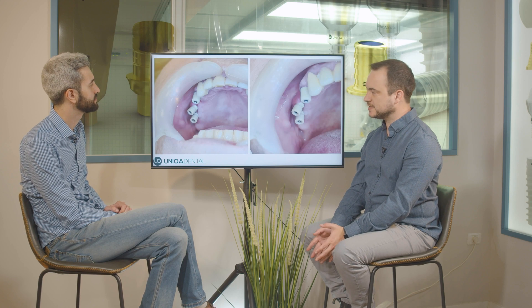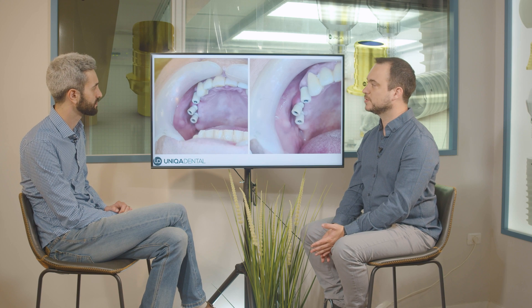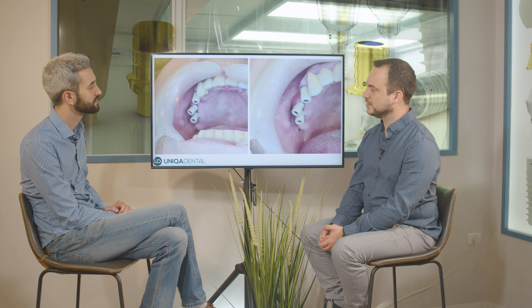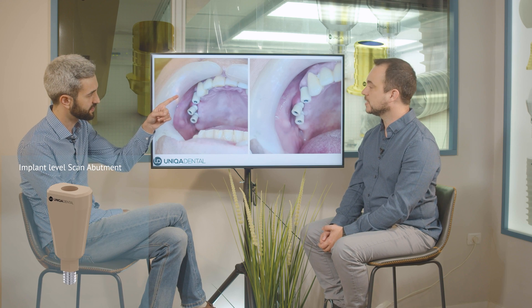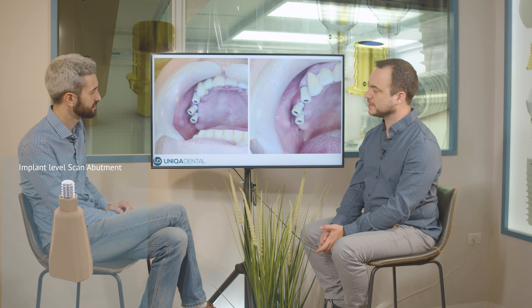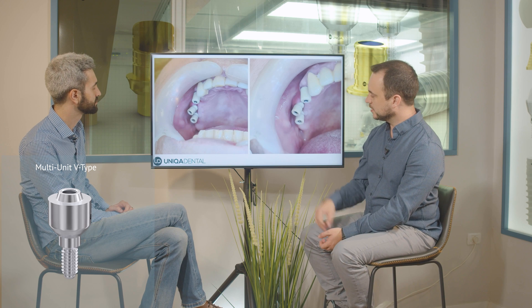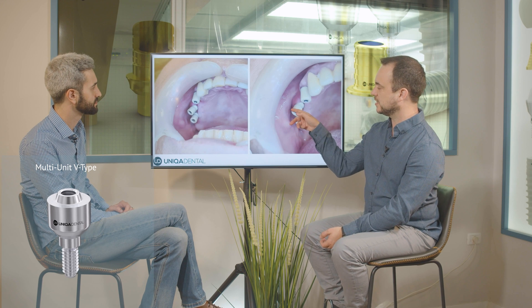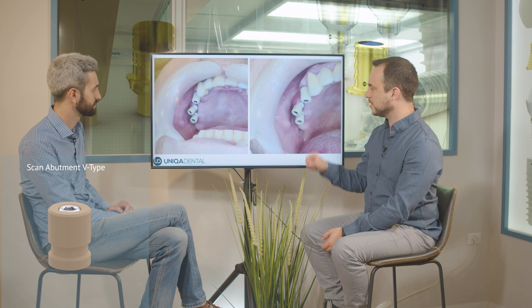We placed three implants — two implants between the teeth that we extracted and one implant mesially, near tooth number 14. Those are implant-level scan abutments. You can see the difference between the different multi-units that we used. This multi-unit is a V-type multi-unit — you can see the line on the scan abutment.